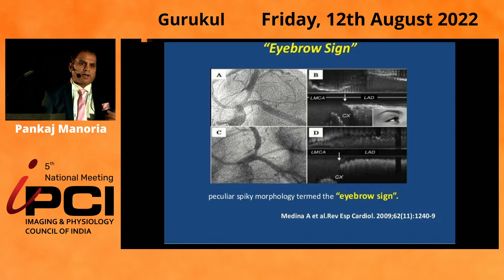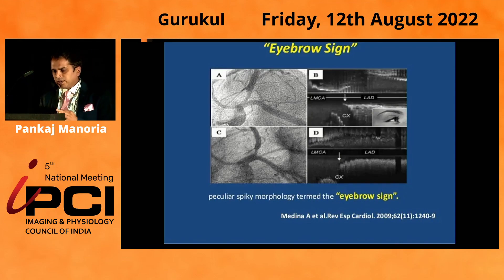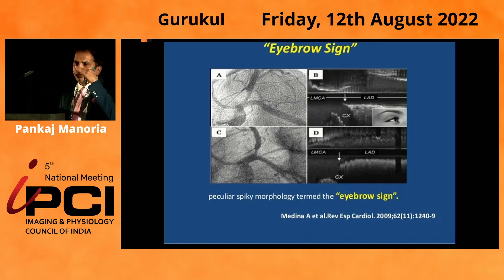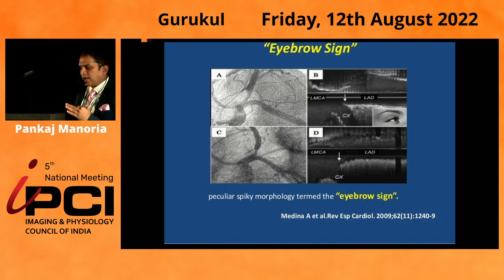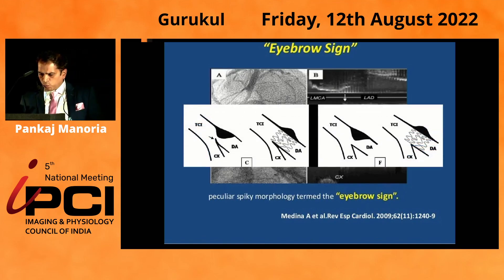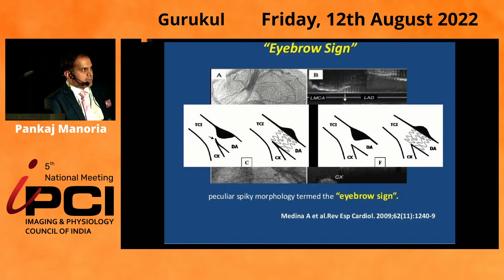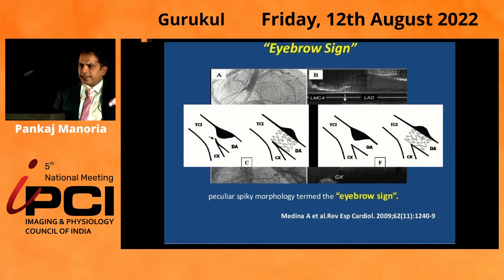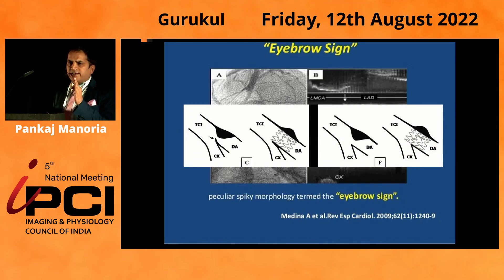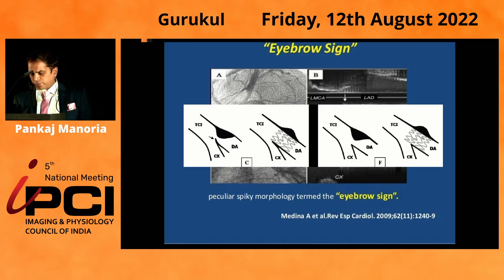Another important feature in vessel analysis is the bifurcation angle. If you see a very hairy, spiky carina — what we call the eyebrow sign — that means the side branch has a high chance of vessel closure. If the carina is very spiky and you implant the main vessel stent, it will push the carina towards the side branch. So whenever we see on IVUS a hairy, spiky carina or eyebrow sign, this is a predictor of side branch closure.